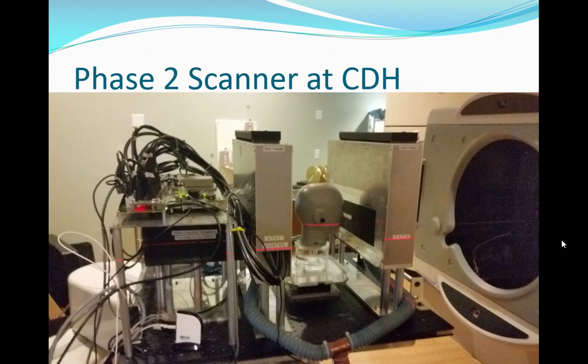Whenever you're doing these, even in medical areas, you'll see this if you get CTs or MRIs. You'll go in and see lasers in the room that are lit. That's to identify that center, the isocenter. That's where the best image comes from, and so you always want to put that on whatever you care about. That's why they always have these lasers built in.